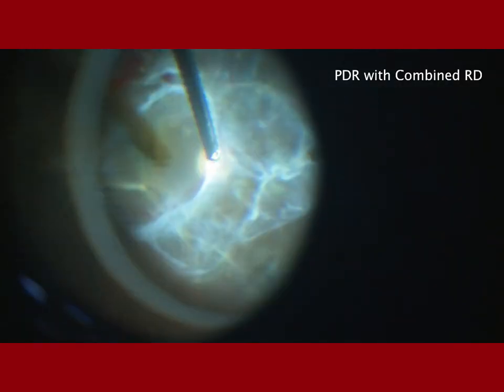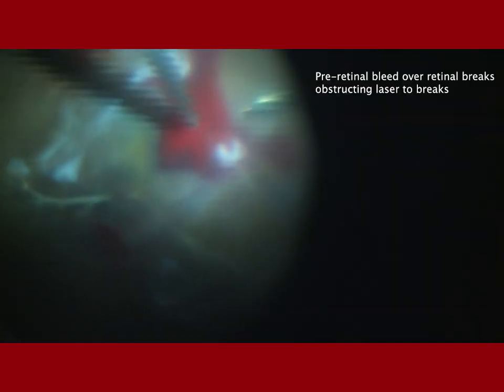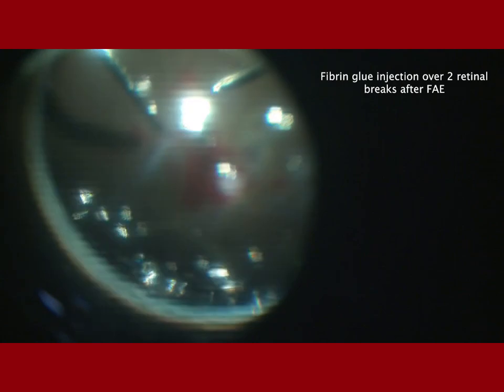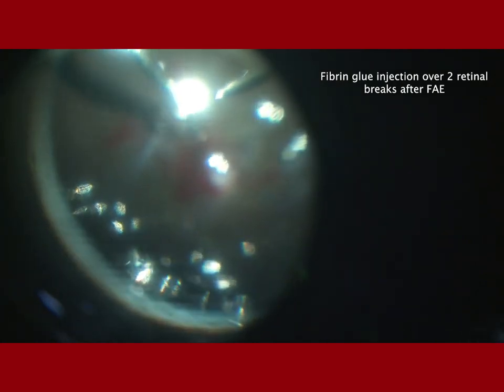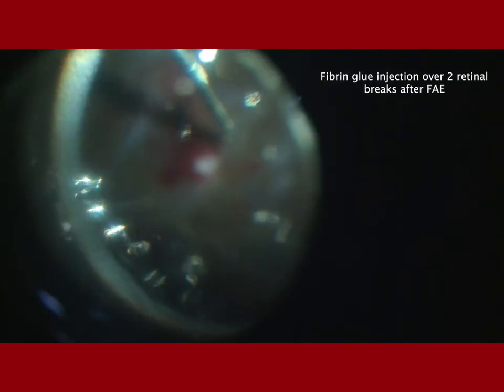This is another patient with PDR combined RD that required extensive membrane peeling and segmentation. There was pre-retinal hemorrhage and an iatrogenic retinal break. Attempts to remove the hemorrhage were unsuccessful, so the two breaks could not be lasered adequately. One was an iatrogenic break and the other a pre-existing break; these were then closed by injection of fibrin glue over each of the two breaks sequentially.